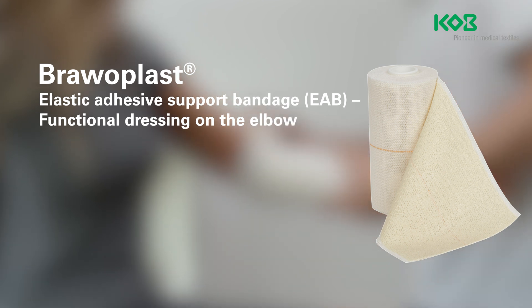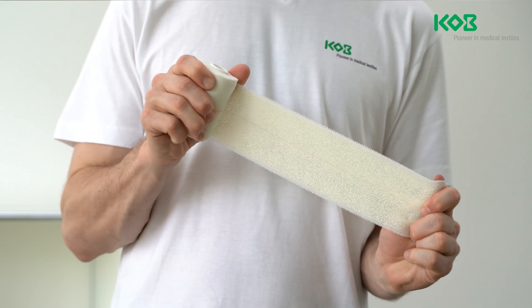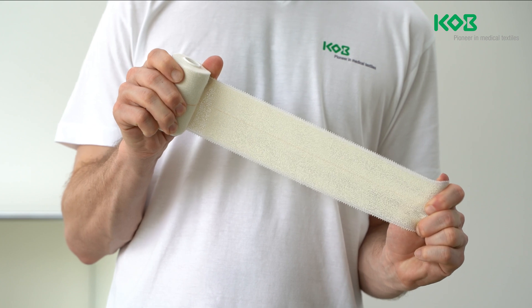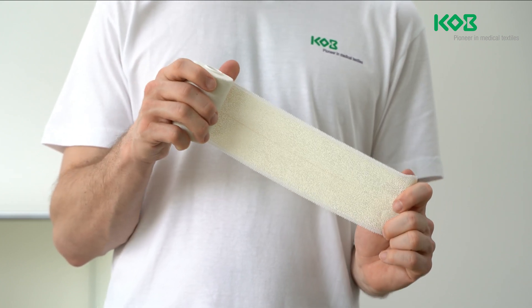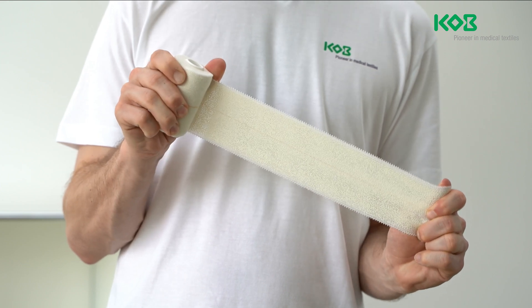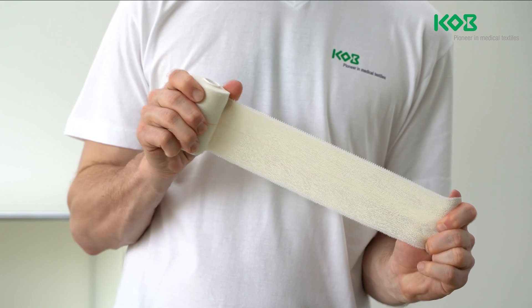Bravo Plast can also be used as a support and relief dressing for injuries of the musculoskeletal system and for gentle compression after blunt injuries or for prevention. The bandage stabilizes the joint while still allowing a range of motion. The uniform pressure created by the dressing can prevent the development of edema and swelling.